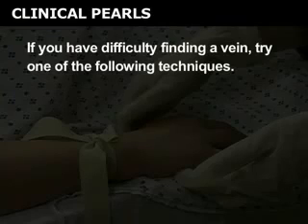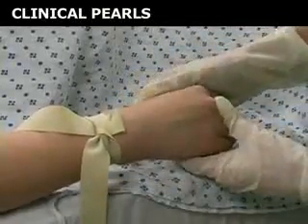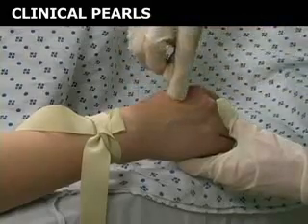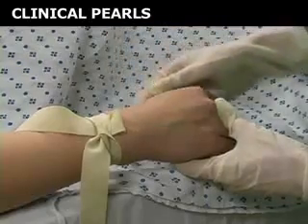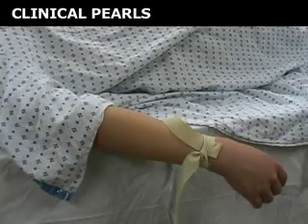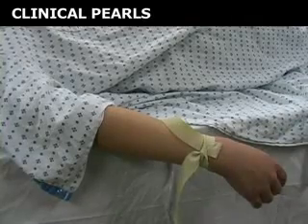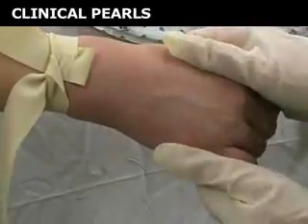If you have difficulty finding a vein, try one of the following techniques. Tie the tourniquet above the patient's wrist and re-examine the hand. This allows venous blood to accumulate in the vessel and will engorge the vein, making it easier to recognize. Ensure that the extremity is positioned below the level of the patient's heart. This will passively fill the veins with blood and improve your ability to visualize a vein. Gently tap on the vein, encouraging venous filling of the vessel.